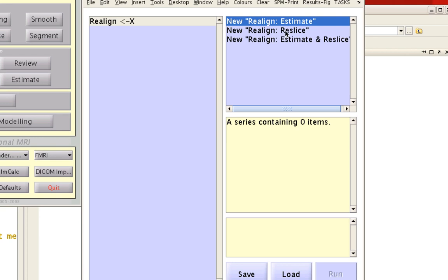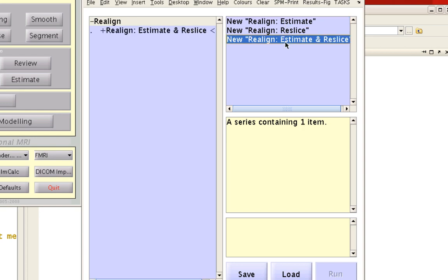Reslicing is the next step in which all these different volumes are resliced or reoriented to match a reference image, in this case the first image of each run. To do both, you can select Estimate and Reslice.